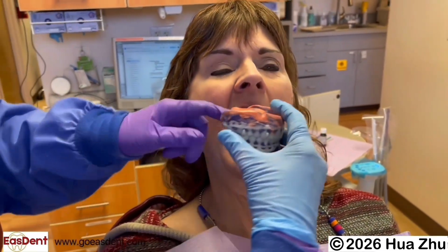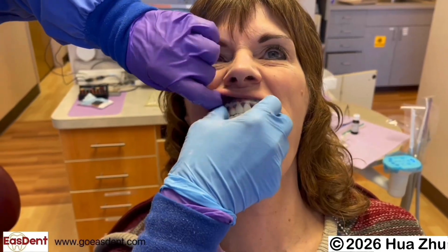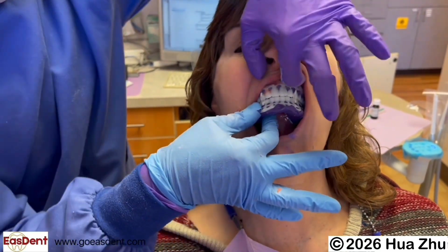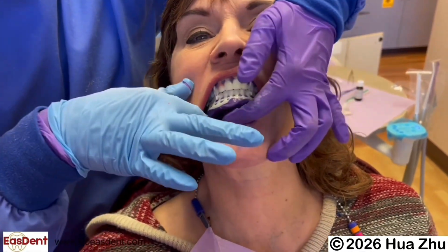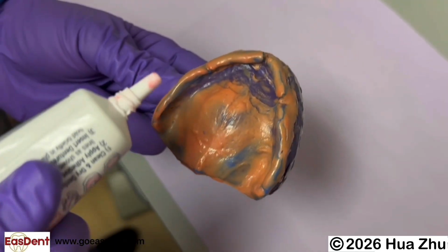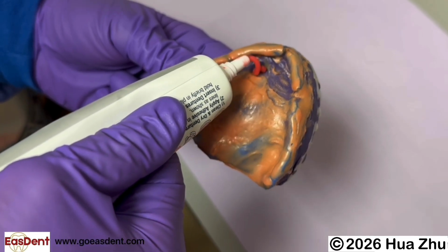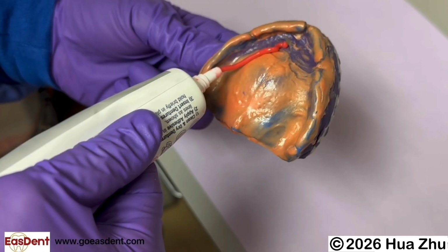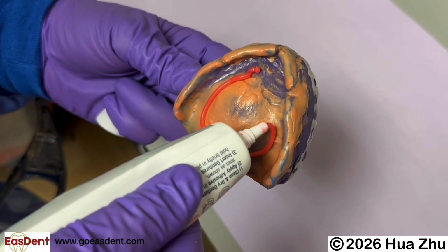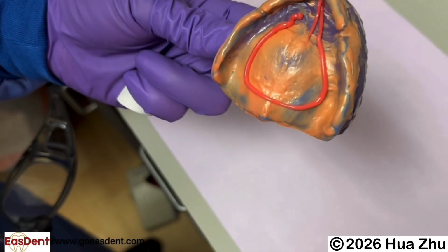Seat the maxillary Easdent impression together with the mandibular tray completely in the mouth. A good maxillary impression should have slight suction and remain stable in the mouth without support. If the maxillary impression is unstable due to severe ridge resorption, apply a small amount of denture adhesive to the tissue surface of the maxillary Easdent impression before seating it. This will stabilize the impression in the mouth and eliminate the need to hold it in place by hand.